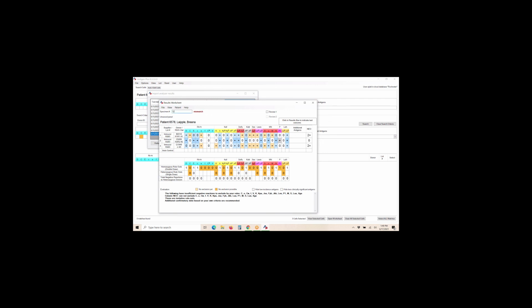And you are going to have to put in a sample number when it's coming from an analyzer. That way, you're linking your patient to the sample that came off of the machine. Whatever your specimen number is that you're using in your lab will be the number that you put in there. So Alex, are you saying that this program, you can interface this to the instrument? Yes, right.